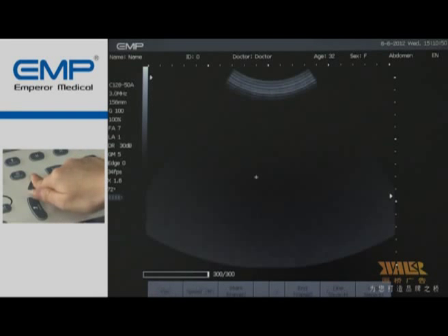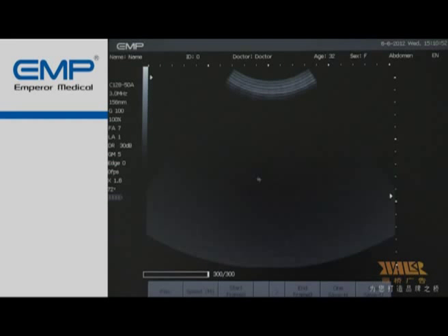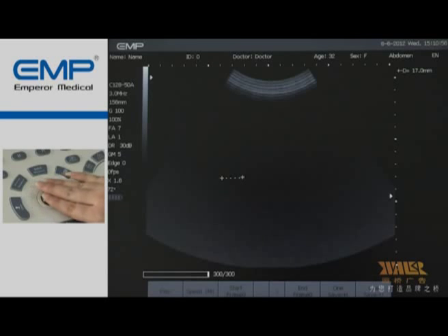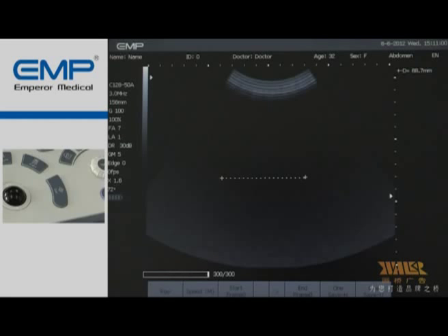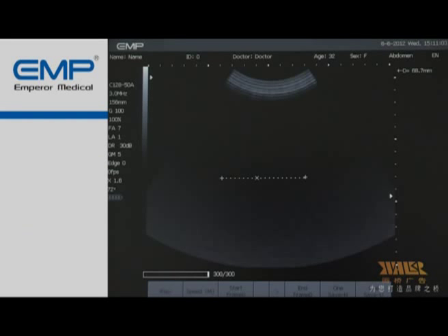Most measurements can be done by N5, such as measuring distance, area, volume, ratio, and so on. When we need to measure the distance, first press the distance button and move the trackball to a point. Press Set and move to another point. Press Set again. The distance between these 2 points will be measured.